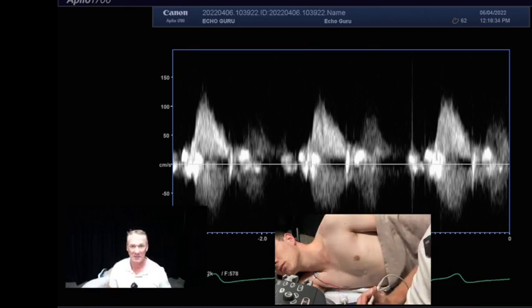And I was chatting away to you then. It wasn't just put it on and get the picture. If you practice with it, it doesn't take long, it doesn't add much to the length of the study, and you get a lot of extra data.